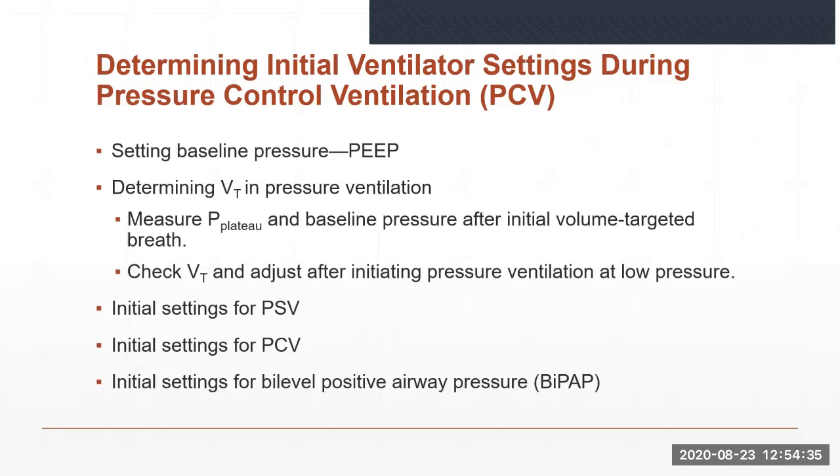The patient's alveolar pressure can be estimated by observing the flow curve. If the flow drops to 0 before inspiration ends, then the applied pressure is reaching the alveolar level by the end of inspiration. If inspiration ends before the flow reaches 0, then alveolar pressure is less than applied pressure, but it's not measurable. In this case, inspiratory time may need to be adjusted depending on patient need and tidal volume delivery.